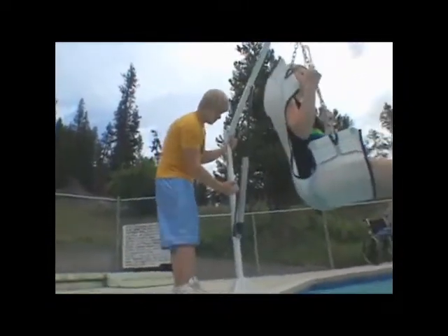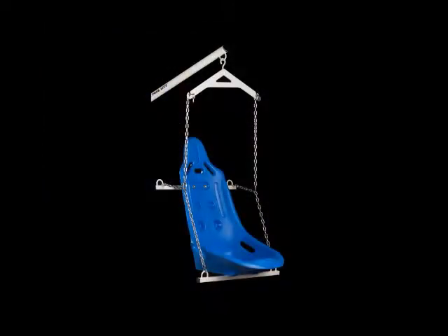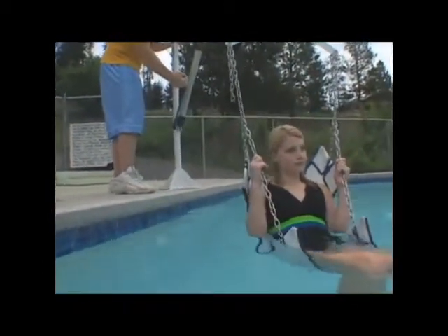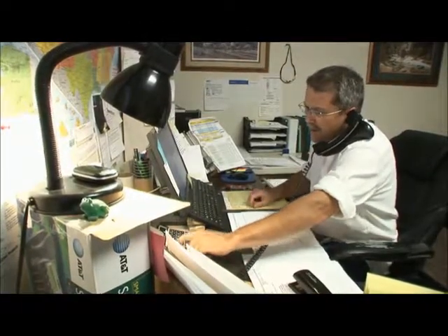The standard sling seat conforms to the user's body, providing comfort and security. An optional hard seat is also available. The Easy Lift comes complete with a lifetime structural warranty and a one-year limited hydraulics warranty backed by Aqua Creek's outstanding customer service.